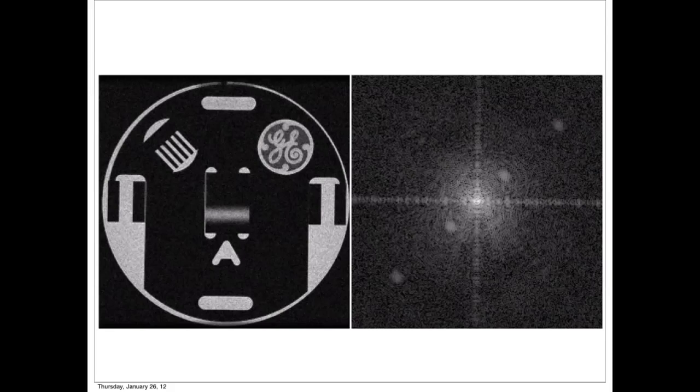Okay, so here's the two-dimensional Fourier transform of this object. And it's interesting because you see a few features here, right? Like you can definitely see these vertical lines. And then I don't know if there's a lot of energy over here. And there are these kind of blobs. Does anybody have an idea where each one of these is coming from?